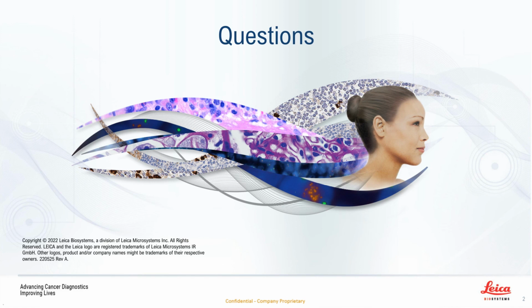Great, thank you. Next question. You mentioned a single focus plane is adequate for 3 to 4 micrometer H&E stained sections. How about for 3 to 4 micrometer sections for FISH? The same single focus plane, or do we need to use Z stacks, at an interval of 1 or 2 micrometers?